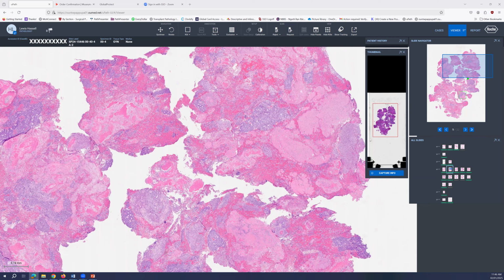and complete loss in the dedifferentiated or undifferentiated components. Additionally, the marking with cytokeratin was distinct in the two. So loss of PAX8 and cytokeratin were noted in this sample.